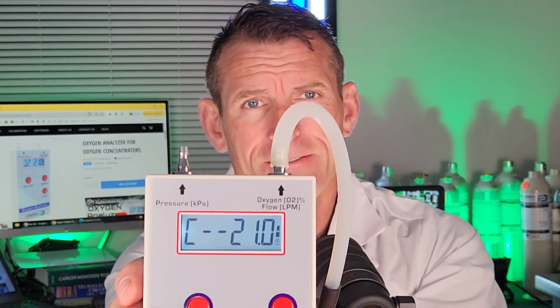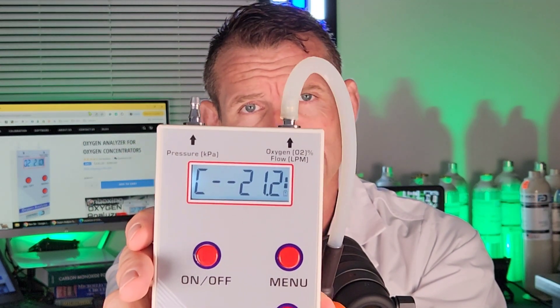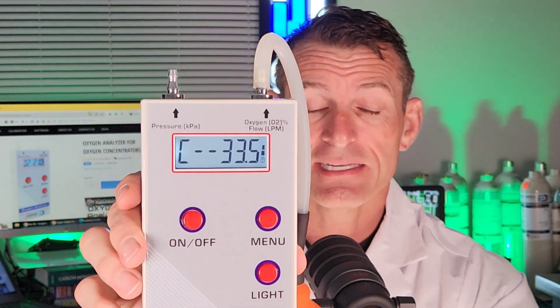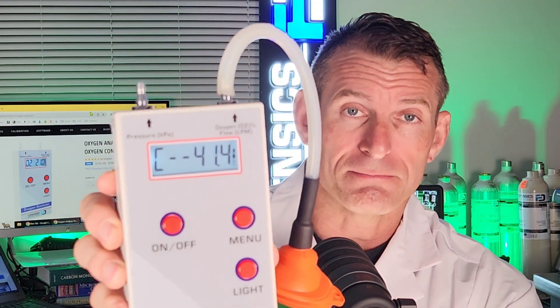We've given love and attention to this unit to make sure it's performing to the specifications we promise. Now, Dr. Coz is going to demonstrate — we have high levels of oxygen, and I'm simply going to put the tubing on the barb and spray some oxygen into the tubing. You can see the numbers going up — watch the sensitivity and responsivity of the unit.